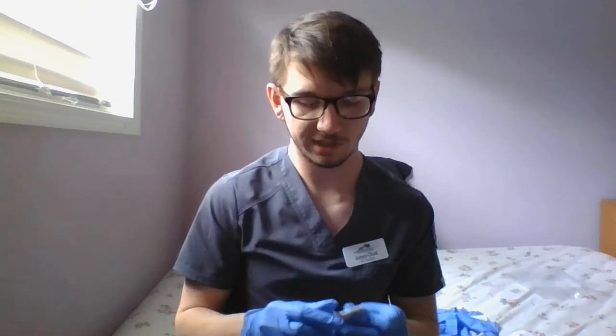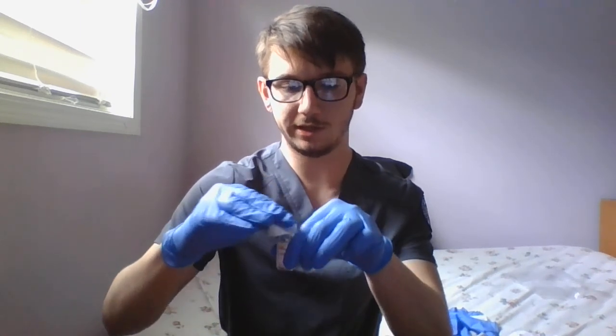Today, for the SubQ injection, we will be giving 6,000 units of heparin, and there's 10,000 units per mL, so it'll be 0.6 mLs of heparin today. Cleaning the top of the vial. Go down.